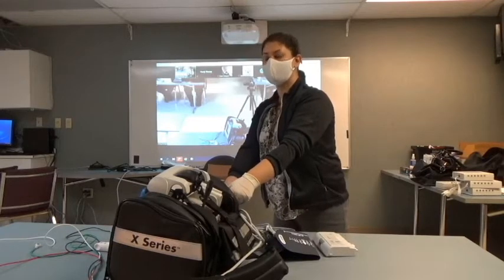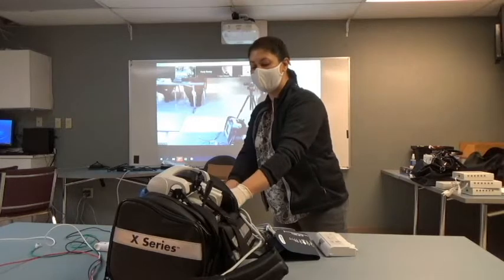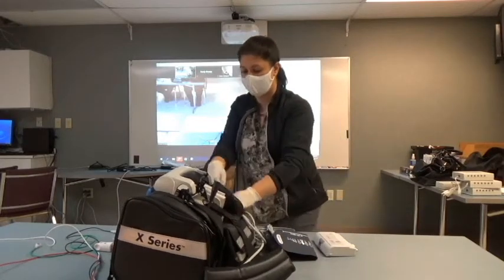You have your printer door inside of here, so that black hinge door is a deflector. If you lift it up, you're gonna find the printer door. This is simply a roll of paper. That's all that it is, a roll of paper.